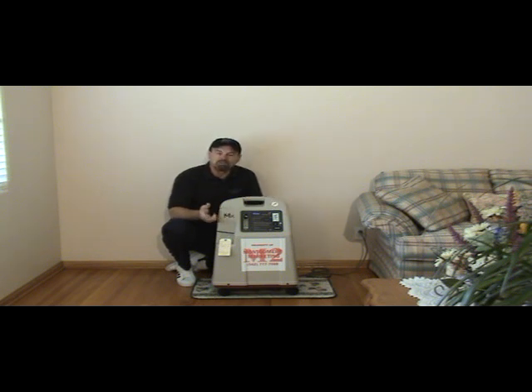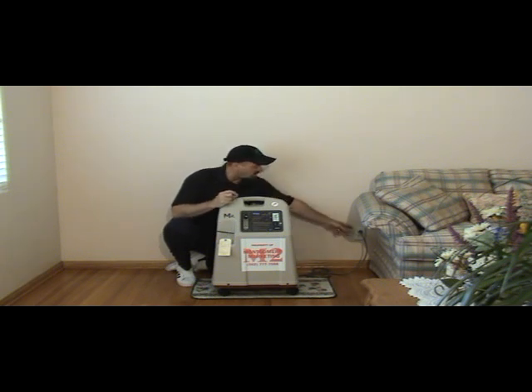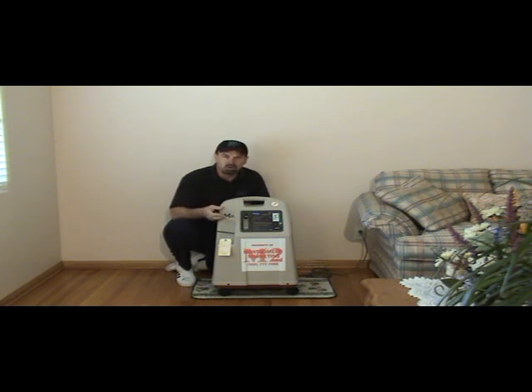So the first thing we're going to do is plug the unit in. Remember that the unit should always be plugged directly into a wall socket as it is here. You should not plug it into an extension cord. That's something that is prohibited by the manufacturer. Okay, so we're all set. We're plugged in, we're ready to go.